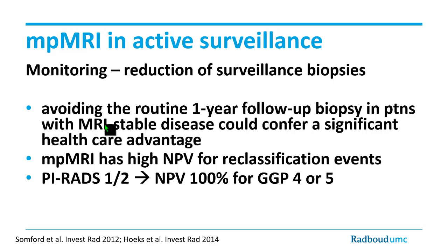But the problem is, what is MRI stable? We don't have clear definitions of what is MRI stable. Is it based on the ADC value? Is it based on the anatomy of the lesion? Is lesion size essential? We don't know yet. That's still some work for us to do.